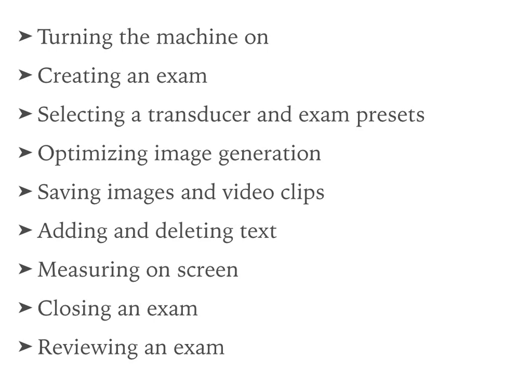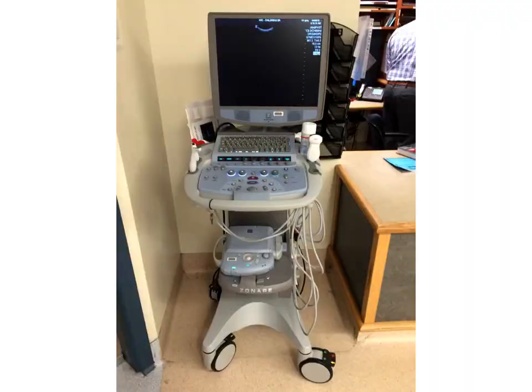exam. This video will not review how to perform certain ultrasound scans, nor if the exam being performed is even the right scan to perform in the first place.